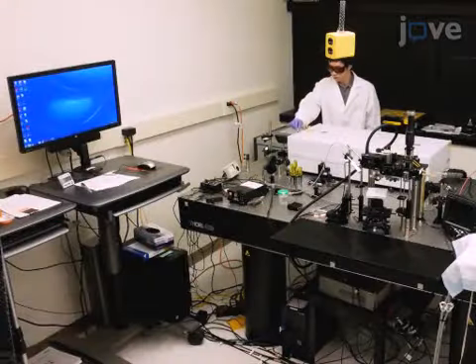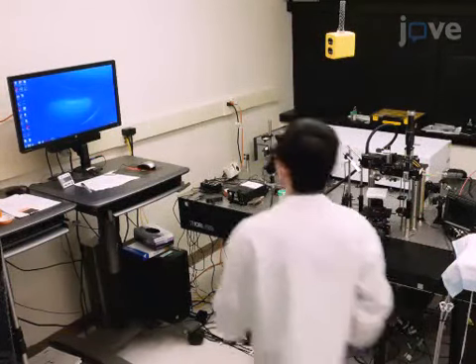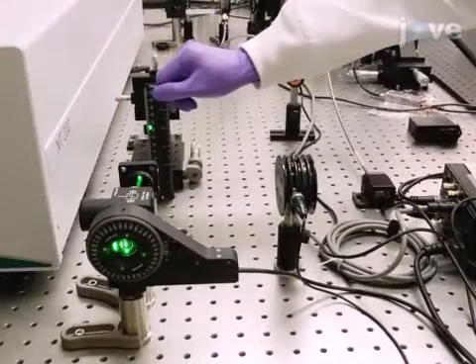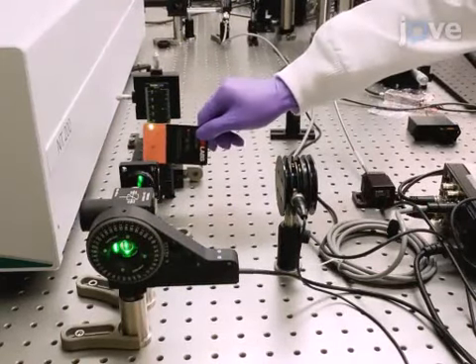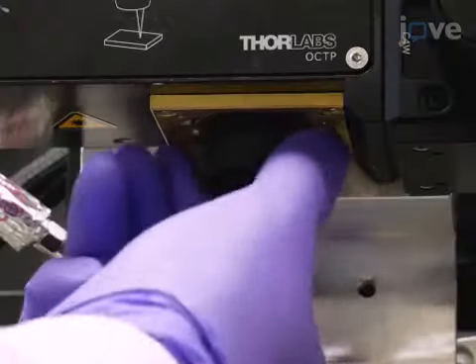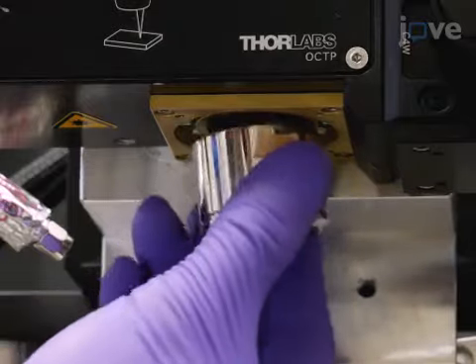To begin, select an optical parametric oscillator laser pumped by a diode pump solid-state laser as the light source for the photoacoustic microscope and use a beam splitter to divide the collimated beam with a split ratio of 90 reflection to 10 transmission. Successively deflect the reflected portion by the M3 mirror and a dichroic mirror, and use a two-dimensional galvanometer to raster scan the reflection.